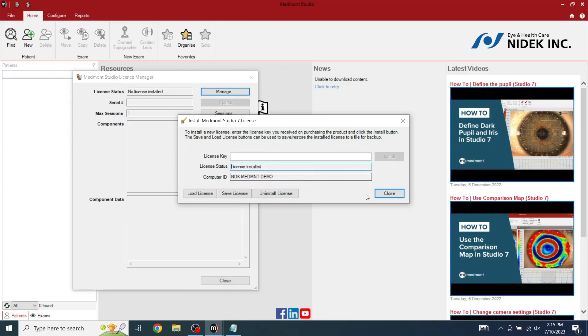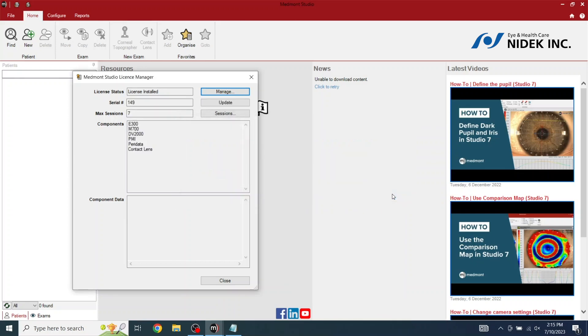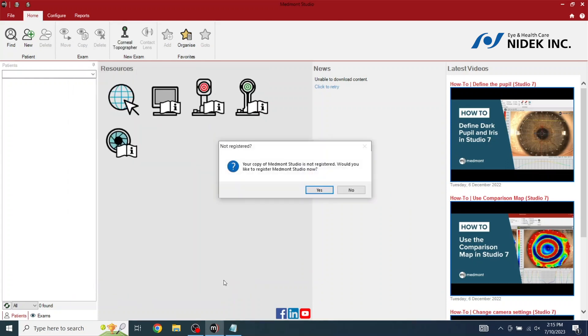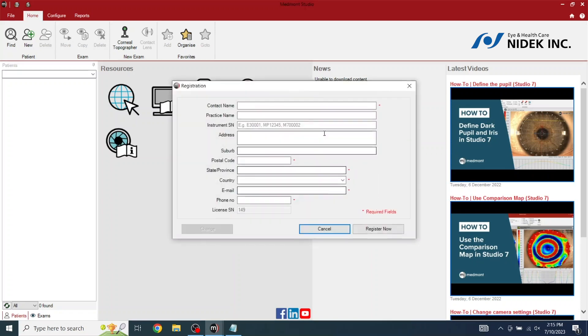Click Install. License is now installed. Select Close. And Close. Medmont Studio is not registered. Would you like to register to the Medmont Studio now? If you select Yes, you can enter in all your fields.